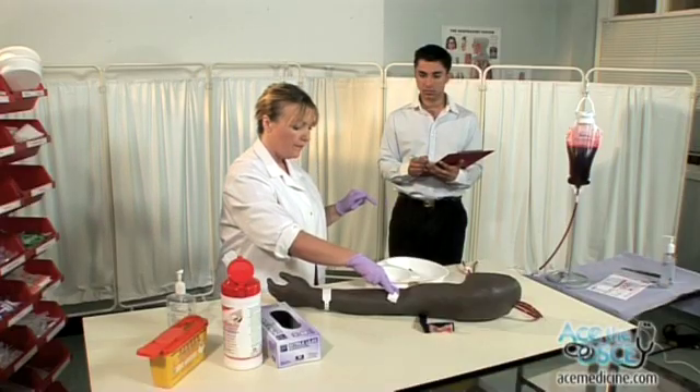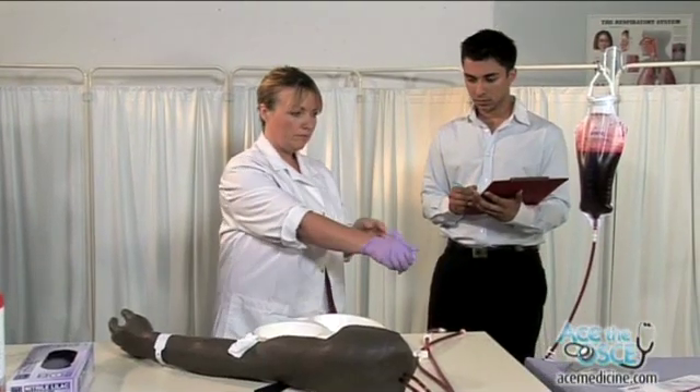Apply gauze to puncture site for one minute. Can you just put some pressure on here, sir? Thank the patient. Thank you. Make them comfortable. Remove your gloves and wash your hands.